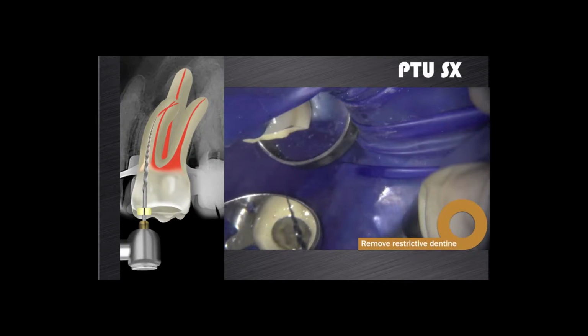In some cases, the inability to negotiate the root canal system, especially for instance the MB2 canal in maxillary molars, is due to the presence of restrictive dentine at the orifice of the canal, causing the file not to enter with straight line access. A very effective instrument that can be used to remove restrictive dentine at this level is the SX instrument from the ProTaper Universal System.